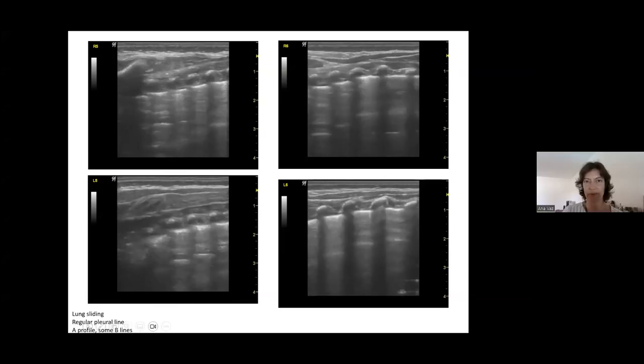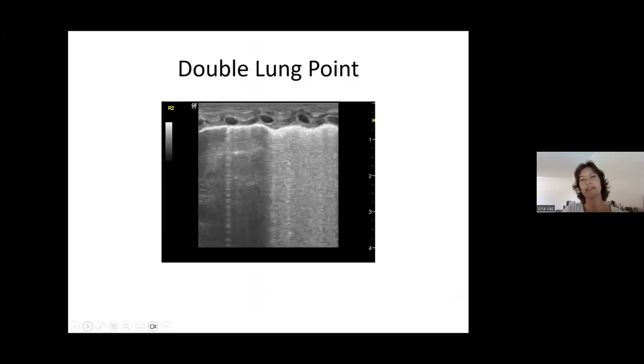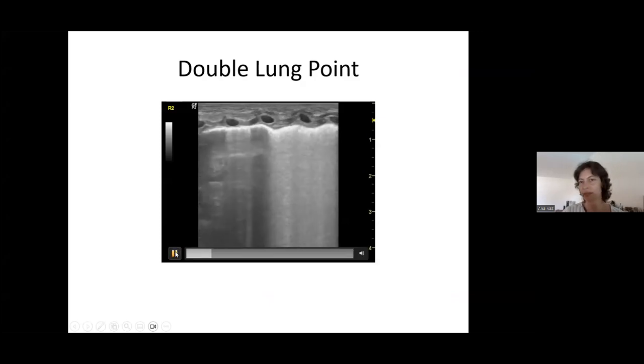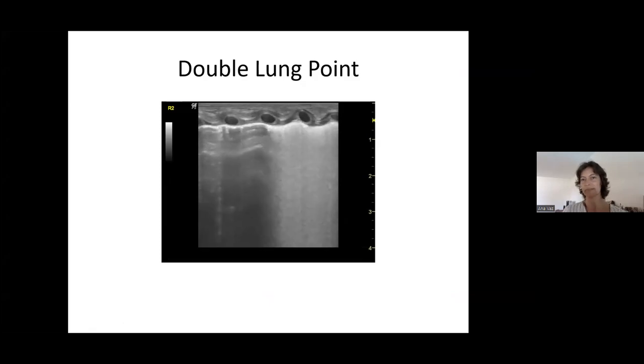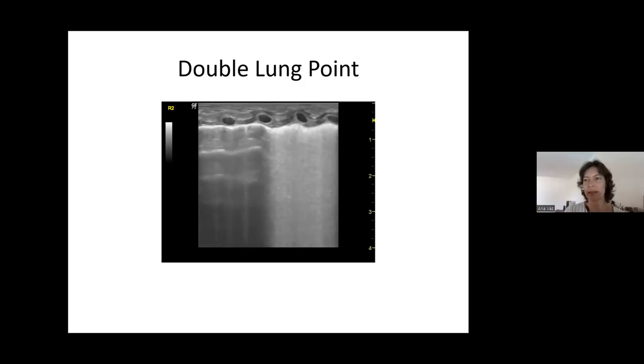It was a good thing for me to not be so worried about the baby. And this was just to show you this double lung point that I picked up yesterday, also in a baby. Yep. Very nice. Very good depth. Lovely bat sign. You've got a beautiful machine. The pleura is so well delineated. You're completely perpendicular. You can see good pleural sliding. And this is a beautiful double lung point. The baby was in room air and was fine.